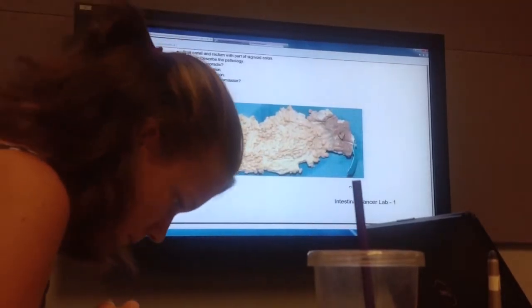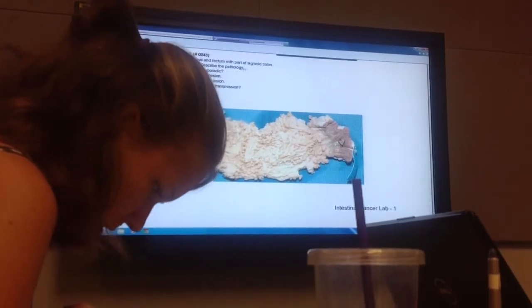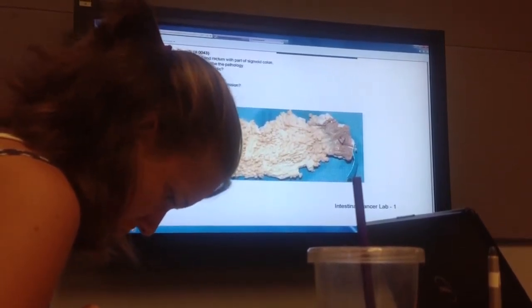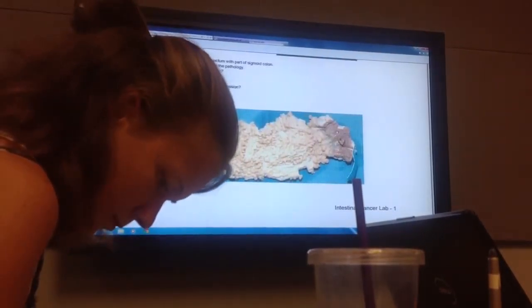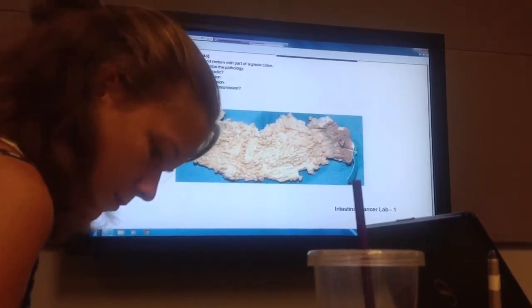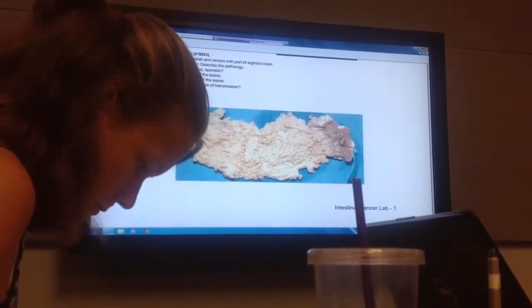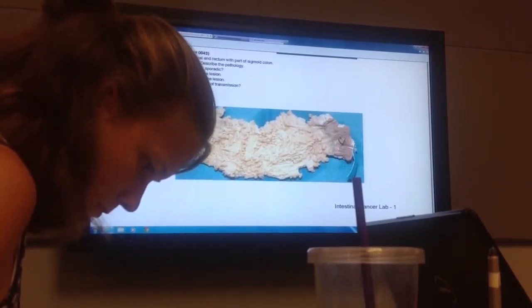Okay. So this is telling us that our specimen is anal canal and rectum with part of sigmoid. Do you see this over here? This looks kind of squamous, right? And then this is clearly a line here. So this is our squamous mucosa. This is kind of a dentate line here. So this would be rectum through here, and then up at this end we might have a bit of sigmoid colon. So what do you see here?